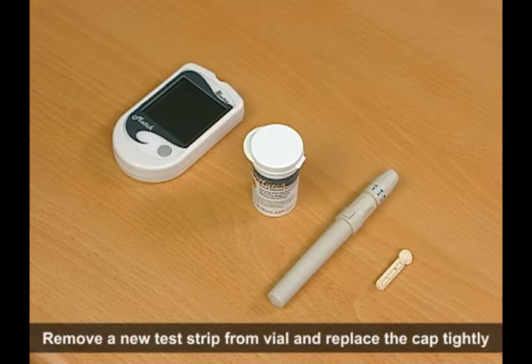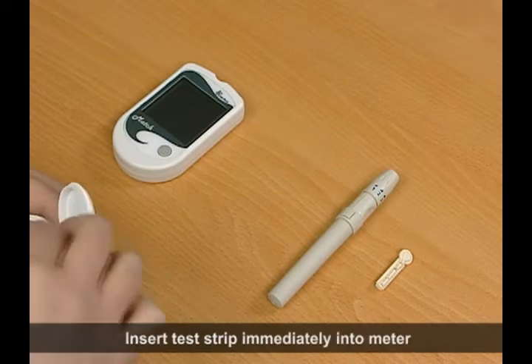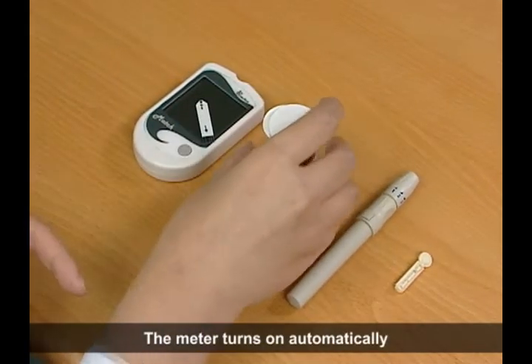Remove a new test strip from the vial and replace the cap tightly. Insert the test strip immediately into the meter — the meter turns on automatically.